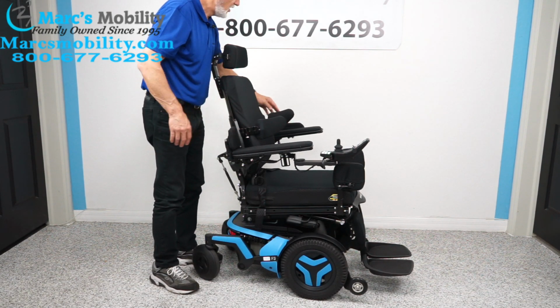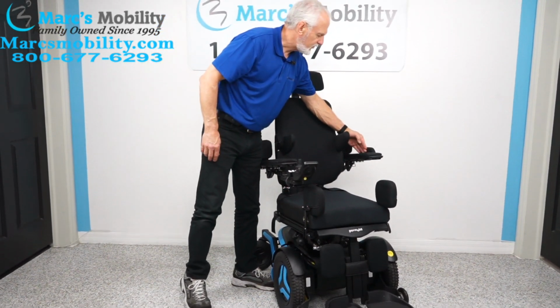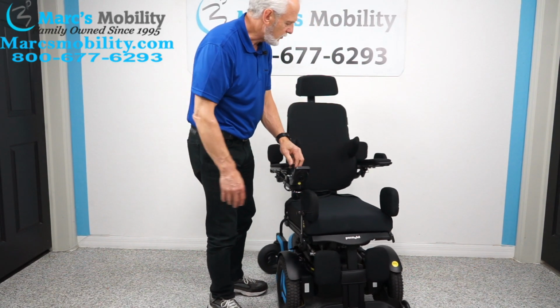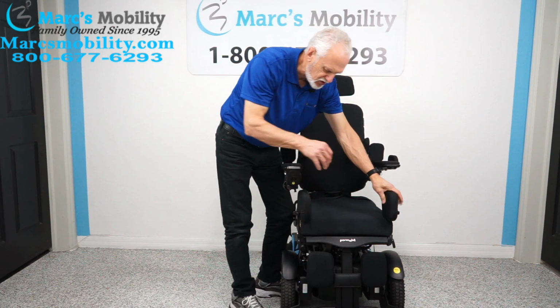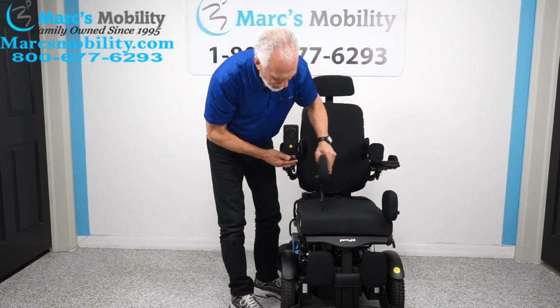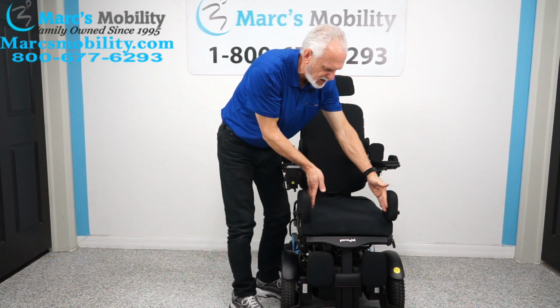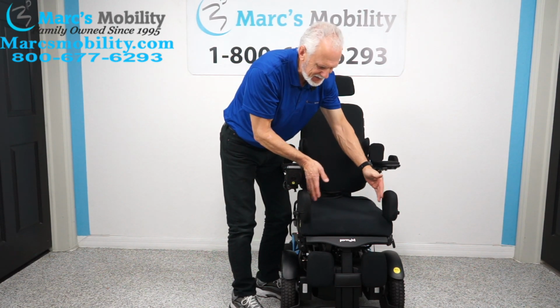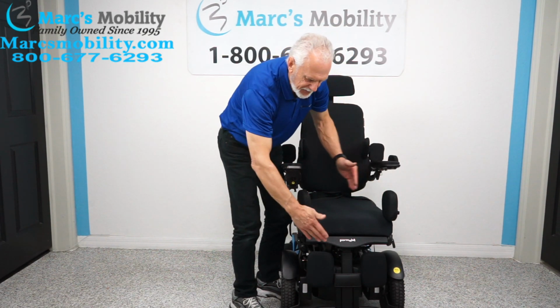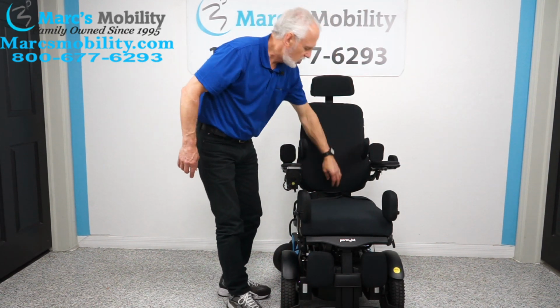There's two of those. On this side, on the left side, there's an arm guard right here, to keep your arm from going off that side. There's only one on that chair, not on this side. You have lateral knee pads, also really nice. They're adjustable. They can go all the way back here, all the way forward, up and down, in and out. They're fully adjustable with all the adjustments. These are nice because they keep your knees together, so your feet stay on the foot plate, instead of your knees buckling out and your foot coming off. Plus you have a little bit of a guard on the foot plate over here, okay? You do have a safety belt.